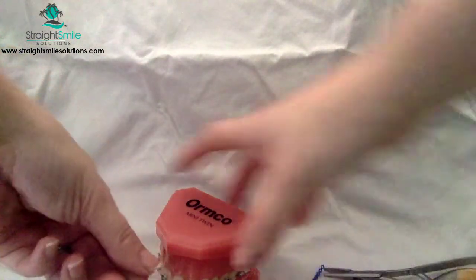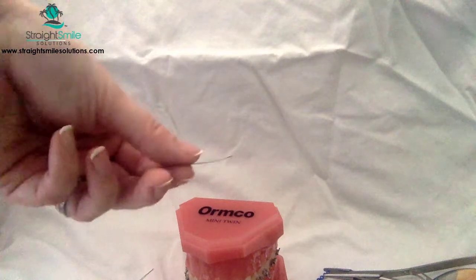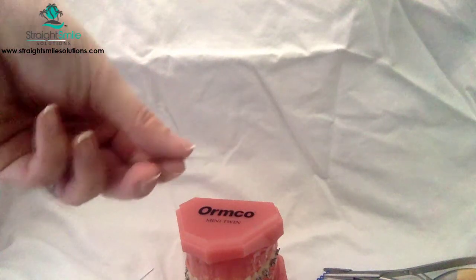Now once you do that, you're not going to be able to easily get that wire back out. Once you tie it in, it's totally stuck in the mouth, so you're going to have to cut it in order to get it out. But that's a great way to ensure that your first wire is not moving around.